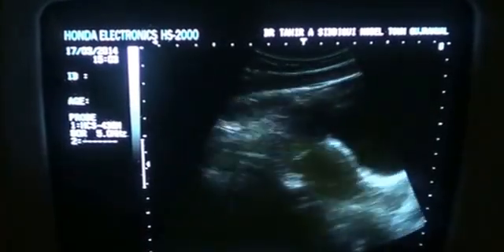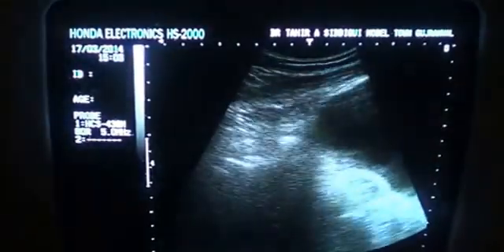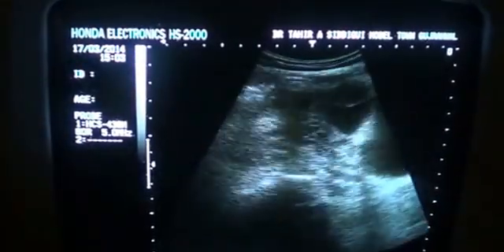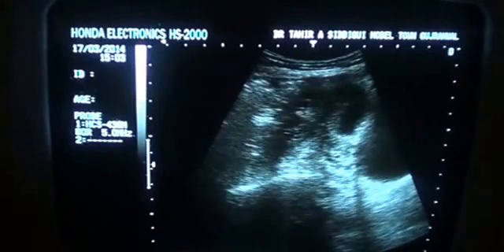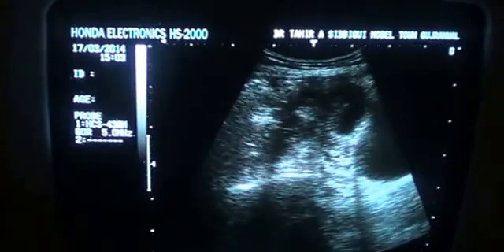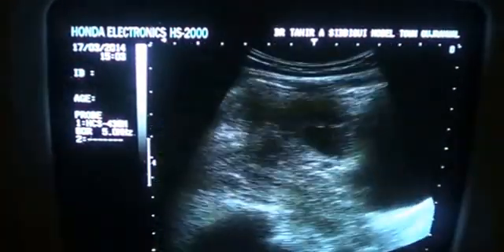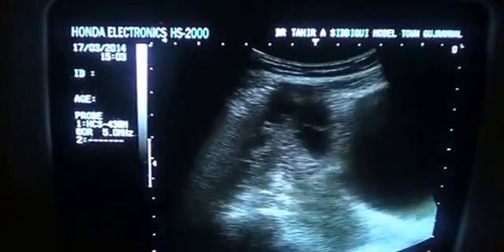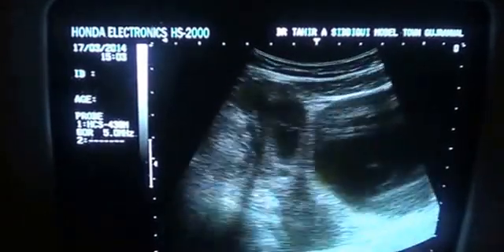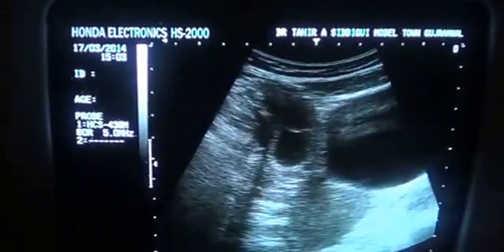When I move the probe transversely and then longitudinally again, and move the probe upwards, there comes into view a complex cystic and solid structure.